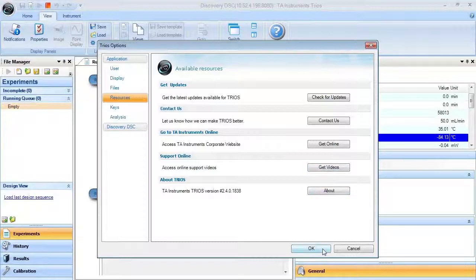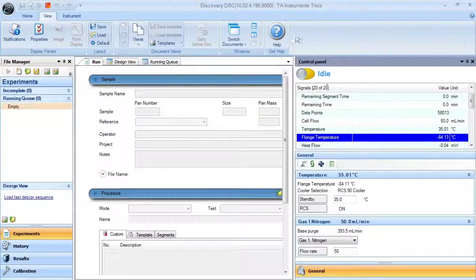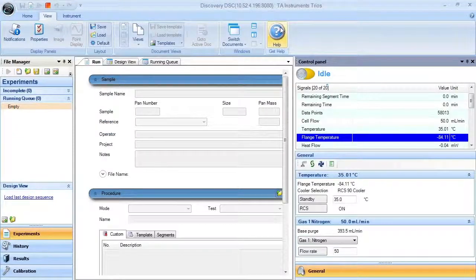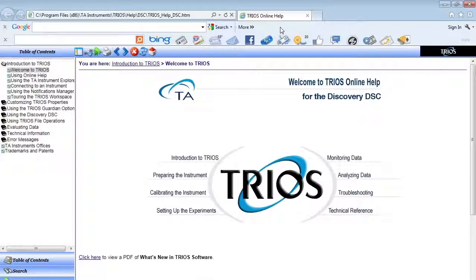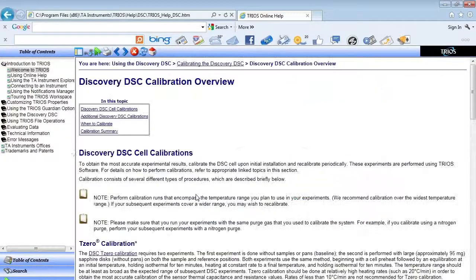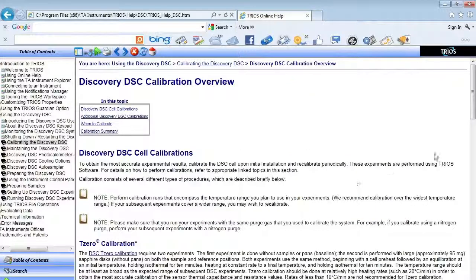Lastly, you will find a wealth of information from the help topics, such as the steps and guidelines for calibrating the DSC for heat flow and temperature and enthalpy.